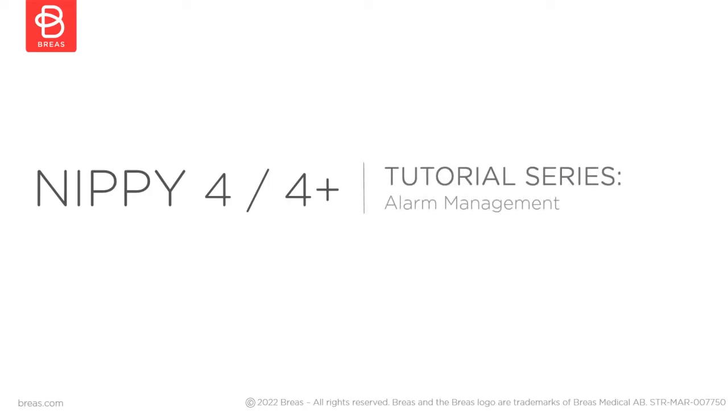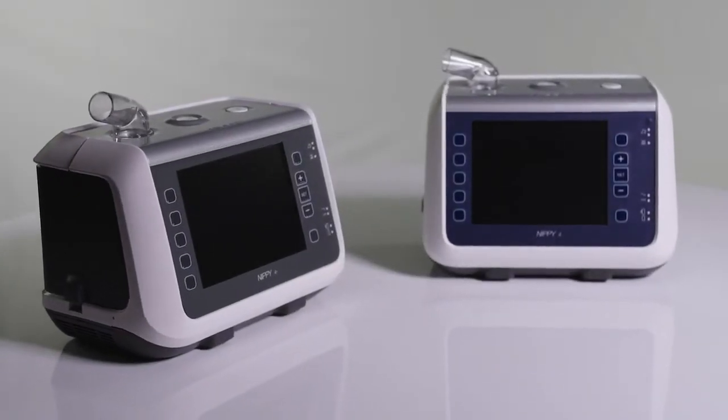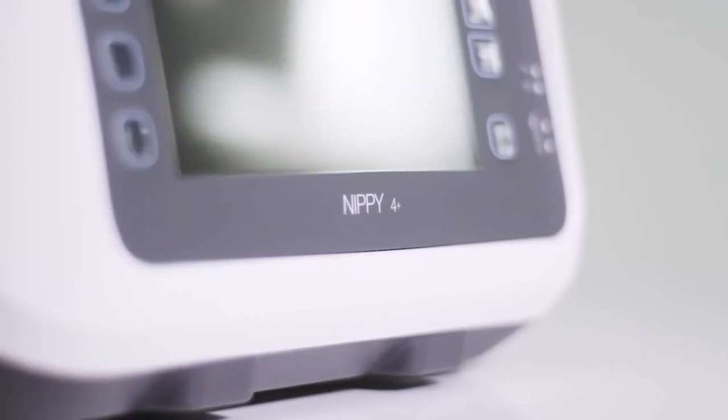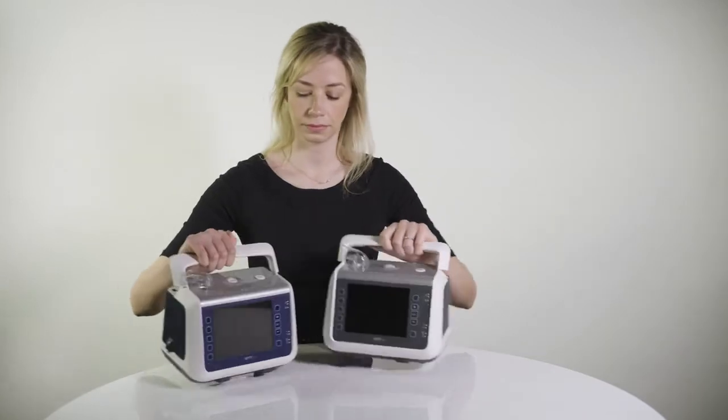In this video, we will show you how some of the primary alarms react in a practical on the NIPPY 4 and 4 Plus. To begin with, we need to consider the types of alarms you may encounter. There are high and medium priority alarms to be aware of, which will appear and sound differently.